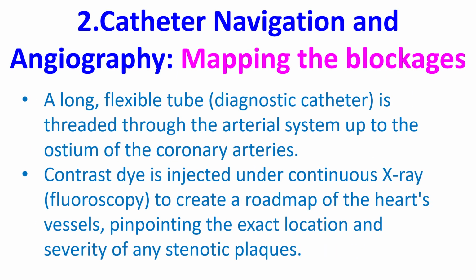Catheter navigation and angiography, mapping the blockages. A long, thin, flexible tube, the diagnostic catheter, is threaded through the arterial system to the ostium of the coronary arteries. The contrast dye is injected under continuous X-ray fluoroscopy imaging to create a roadmap of the heart's vessels, pinpointing the exact location and severity of any stenotic plaques.